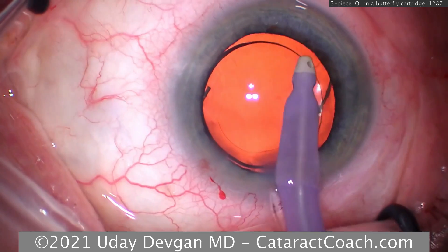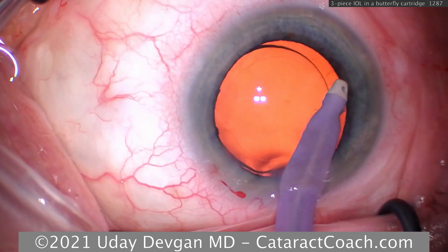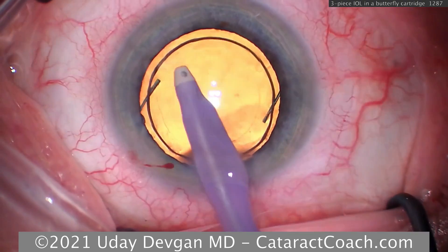Taking out the viscoelastic — this looks like a beautiful case. Make sure you know how to use all these lenses, cartridges, and systems ahead of time, before you go to the operating room, to give your patients the very best.